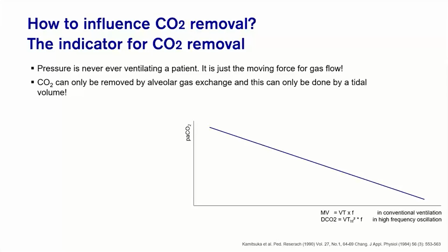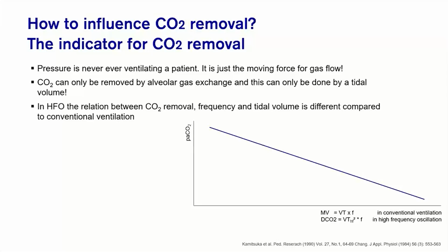We come back to this later today. So I put it here again. The DCO2 is tidal volume to the power of 2 times frequency.